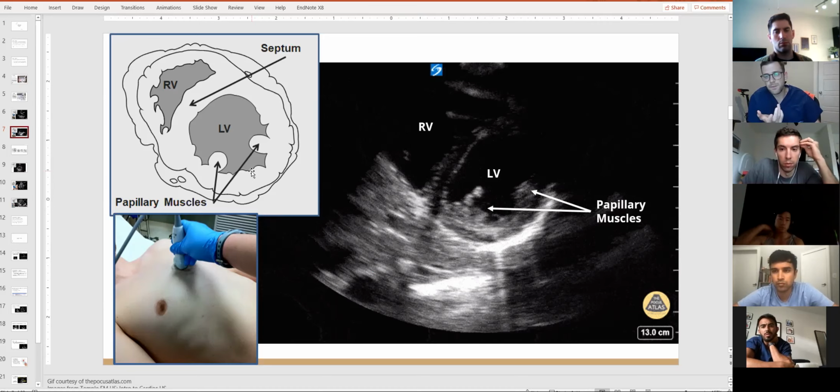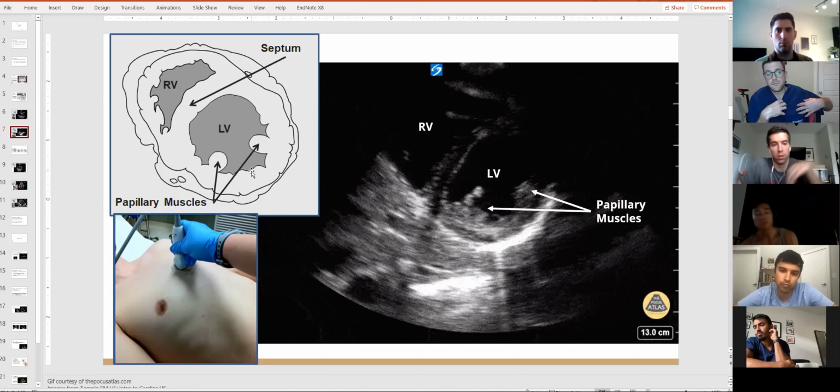And then always remember that people's cardiac anatomy is different. Let's say somebody, for whatever reason, has a large pleural effusion or mediastinal shift. Things can be shifted one direction or the other. People that you tend to have a hard time getting good images on are people that are quite obese, because of scatter from the ultrasound waves. But even harder oftentimes are very, very skinny people because you can't actually get between the rib spaces. So those are people that I actually find most challenging.